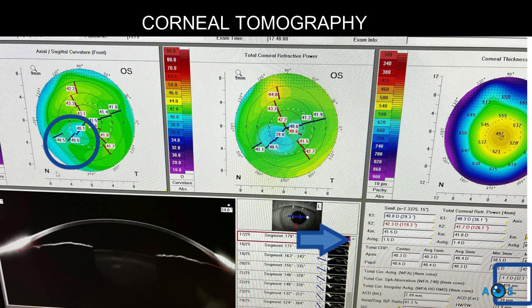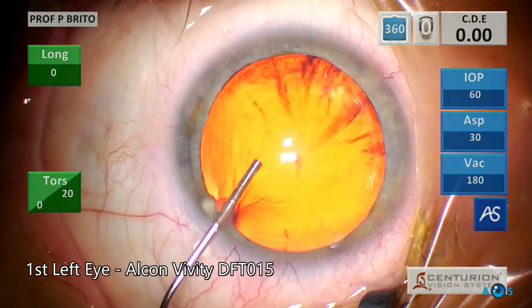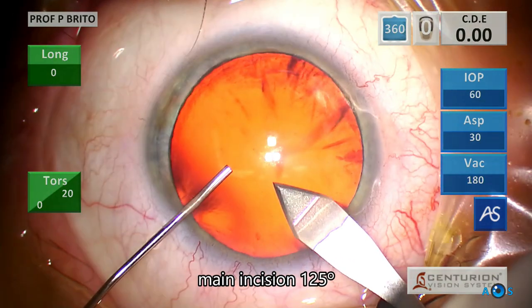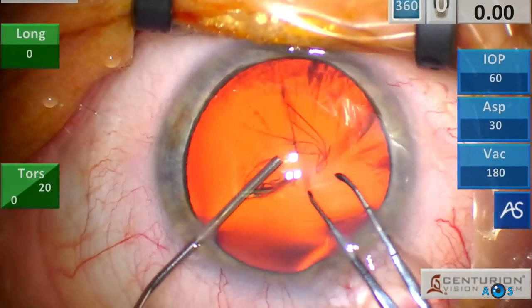Such is the case of this patient, desiring to be completely free of spectacles, but with a small paracentral stromal opacity in his left eye, causing asymmetric astigmatism, therefore not ideal for diffractive lens technologies. The plan was to operate first his left eye with an Edof IOL and two weeks later his right eye with a trifocal diffractive lens.